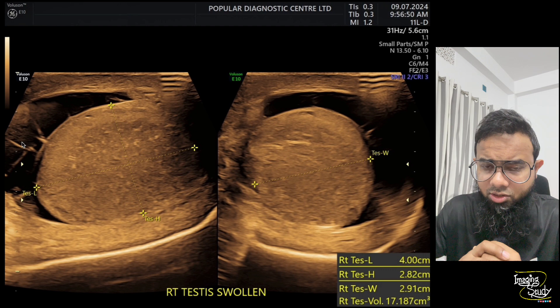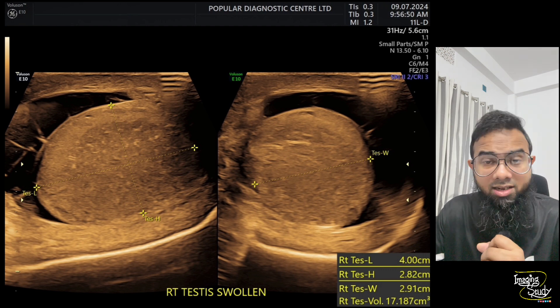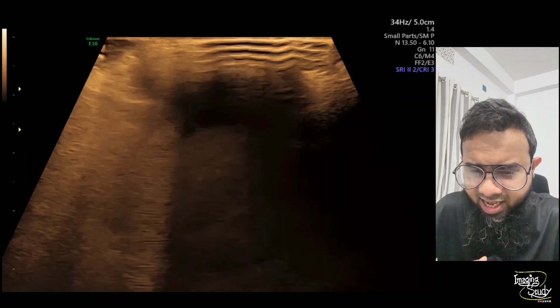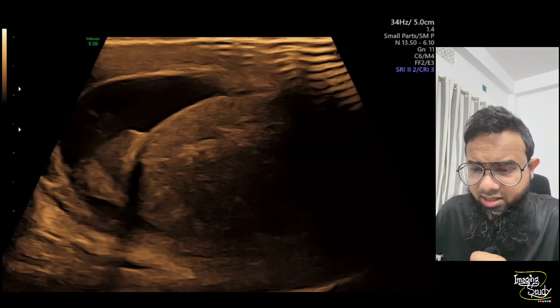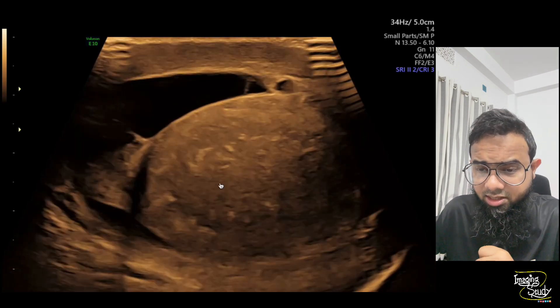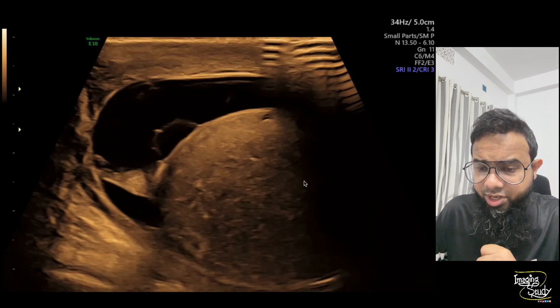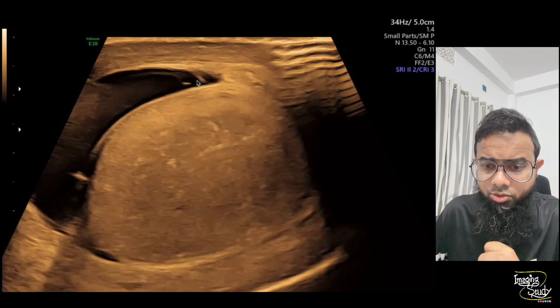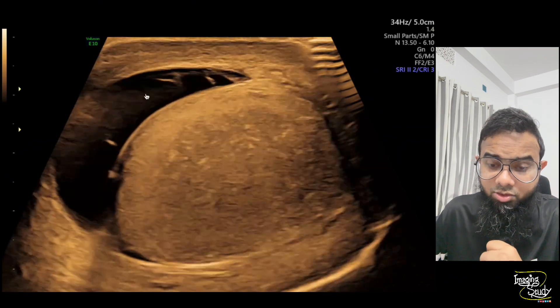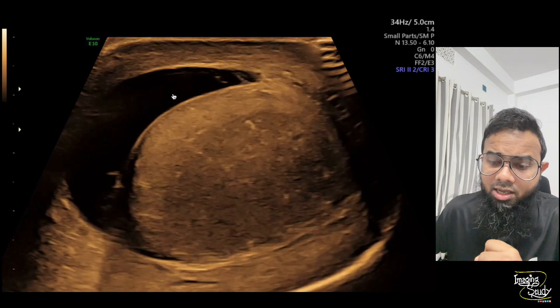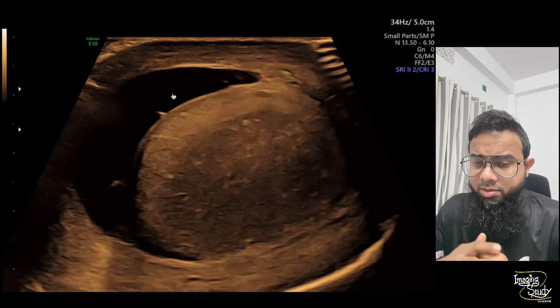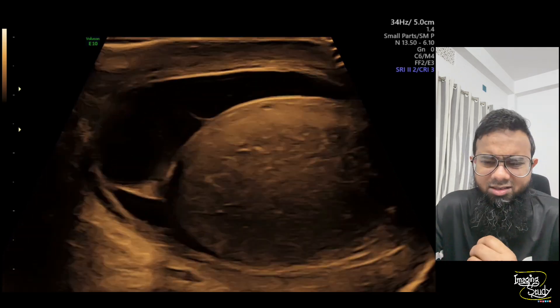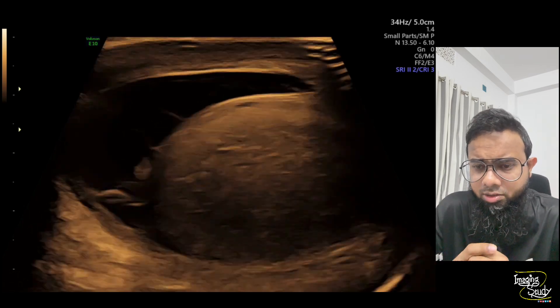Here is the real-time imaging. You can see the testes is heterogeneous with a hypoechoic area, and there is a hydrocele containing some thin septations. This might be a hemorrhagic collection or it might indicate some inflammatory condition — we can't say that without aspiration.